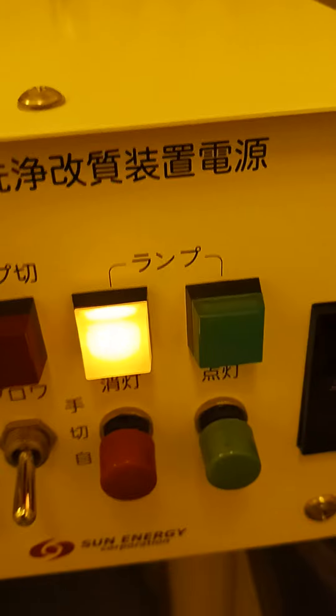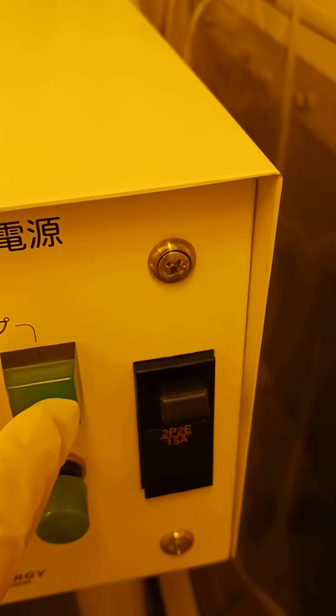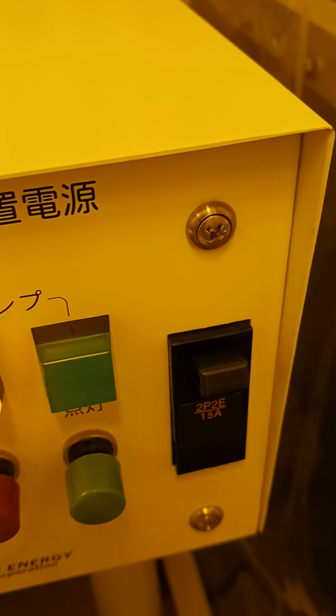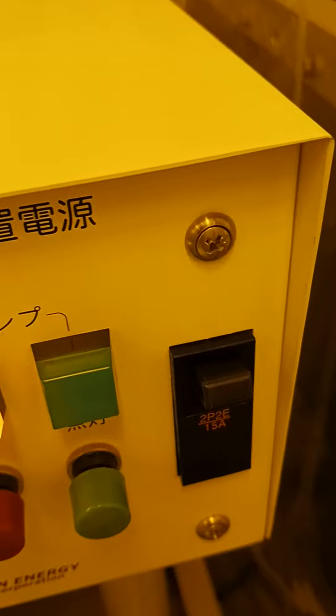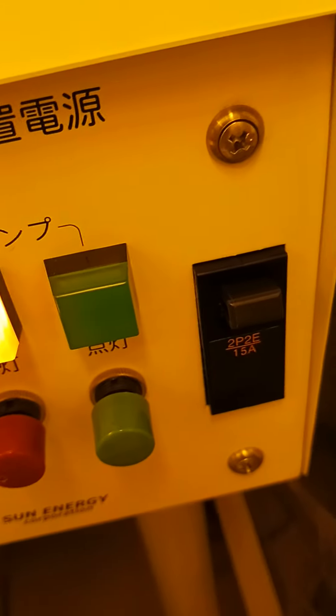Close it like this and close the door — you can operate this machine easily. Here you can see three buttons. The green button is for ozone, and the red button is for UV.